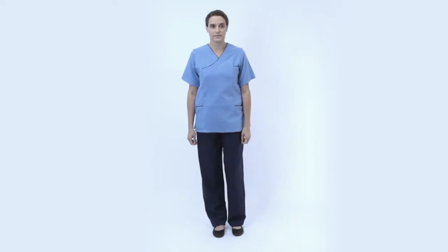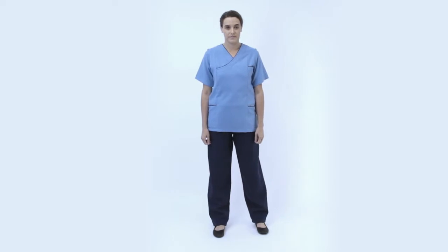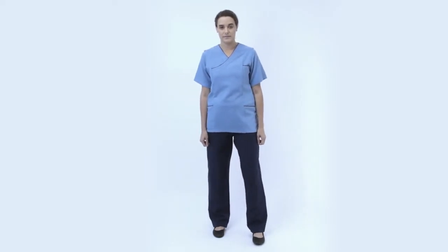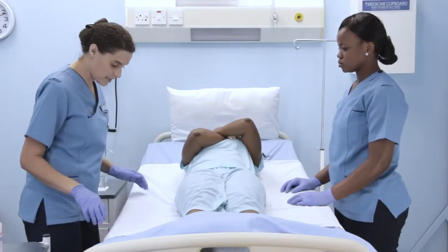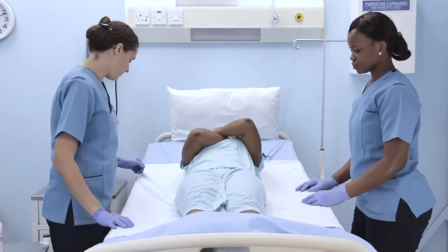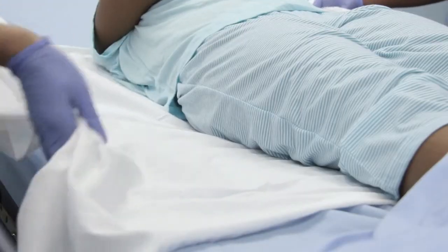Spread your feet so that they are shoulder width apart, with your foot closest to the head of the bed slightly in front of the other, and turn towards the head of the bed. Fan fold or roll the draw sheet as close to the patient's body and grasp it securely.